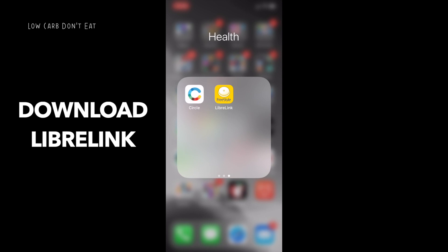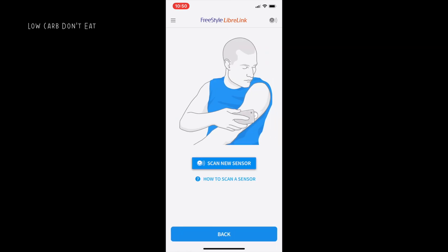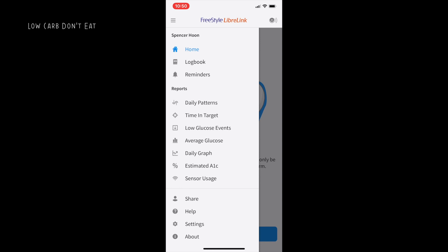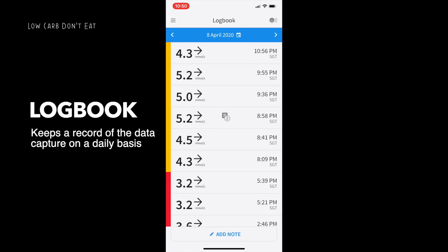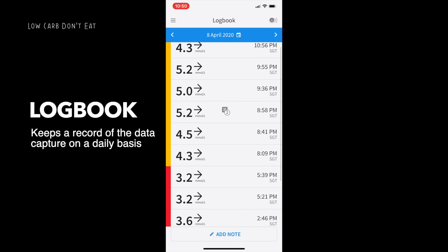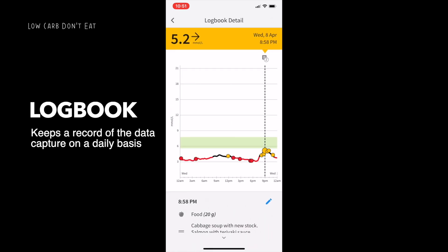Now let's talk about the LibreLink app itself. After downloading it from the app store and registering, at your home page you'll see the logbook function. Click on the logbook and whenever you capture data it will all be recorded on a daily basis. You can see all your scans — for example from the 8th of April I have all these readings. If you want to see the general trend on a chart, click on one of the readings and it shows the overall trend for the entire day.